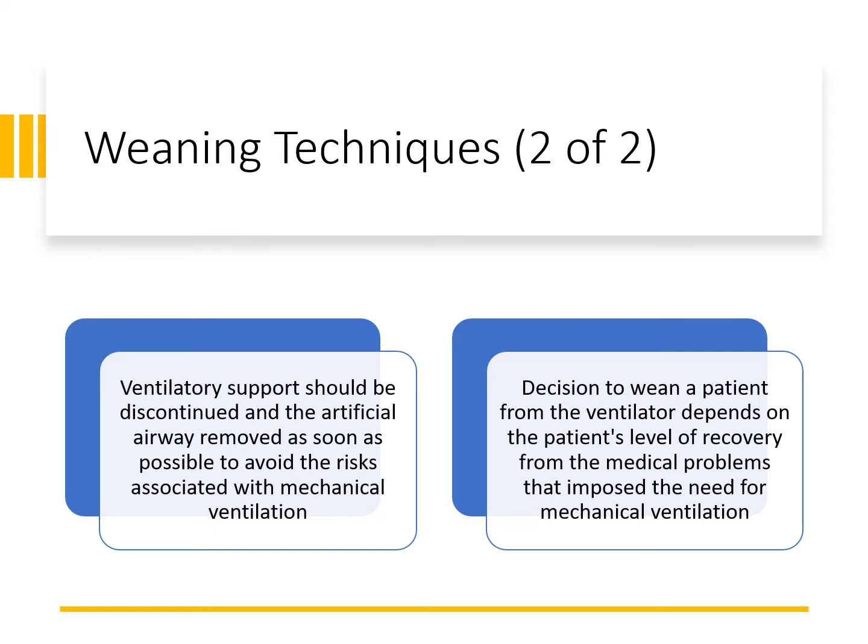So that's one thing you have to balance, right? Where are they at? Are they in that sweet spot where it's probably the right time, or is it too early or too late? This is where you, as part of the care team, can really be a big part of that discussion. So keep your ears and eyes open as well to what the other providers are saying. But weaning depends on the patient's level of recovery from the problems that put them on the vent in the first place. So where are they at in their physical condition?